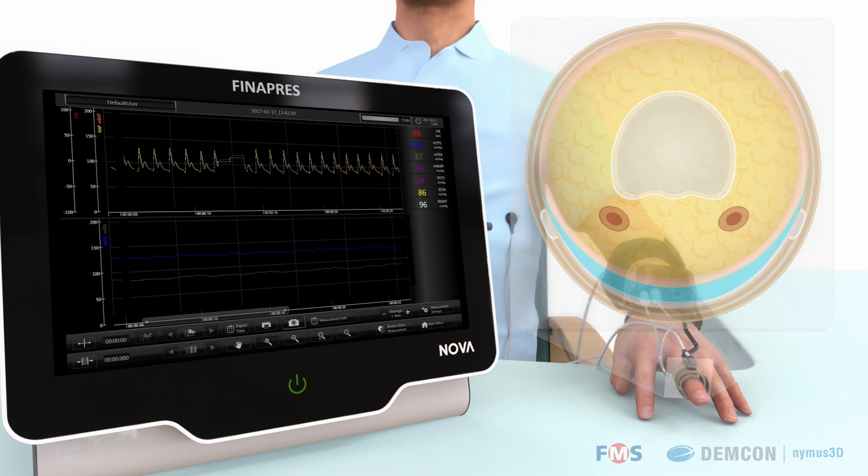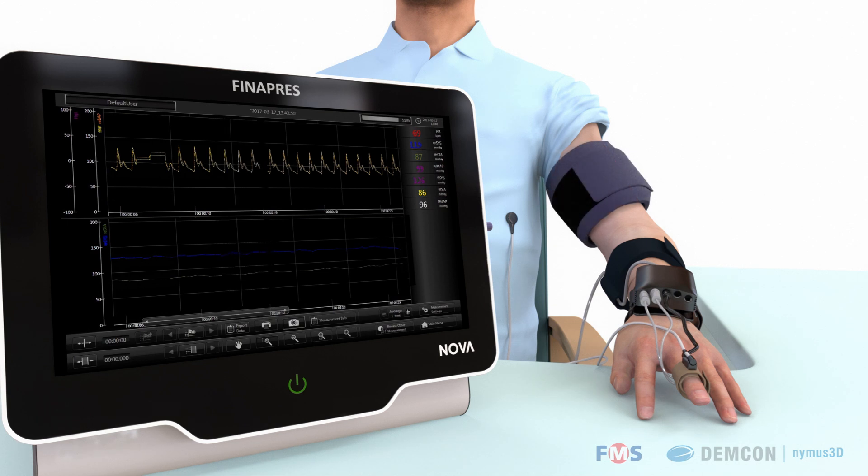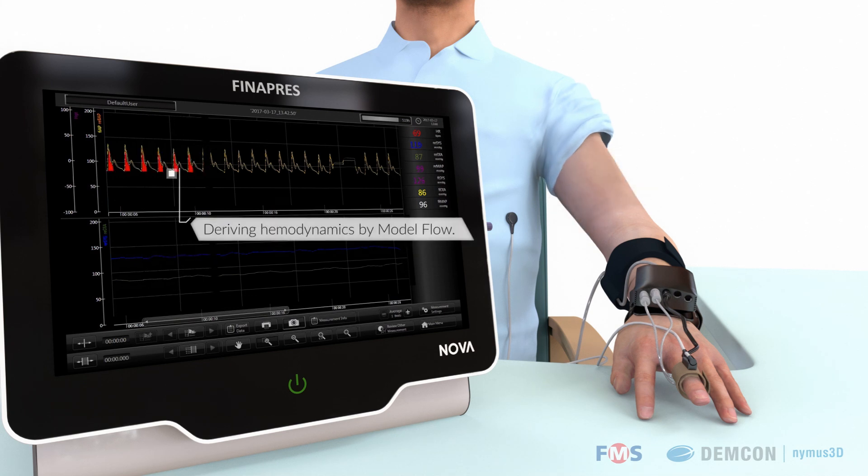The Finapres NOVA also calculates brachial pressure from the measured finger pressure. An arm cuff is used for only a one-time calibration of this calculated brachial arterial pressure. Using the well-validated model flow technology, information about blood flow and hemodynamic parameters can be derived from the blood pressure data.